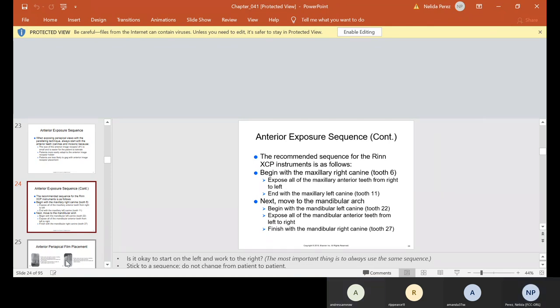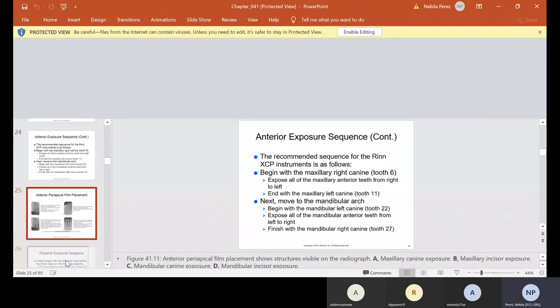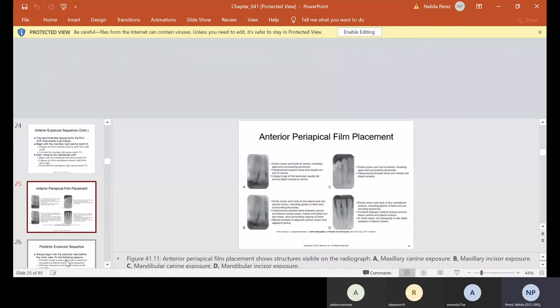It is always important for you to start on the same sequence, and if you always start on the same sequence, your time is going to get better. Here are your anterior periapical film placements — look in your Kindle or your red shelf at figure 41-11 because this is how you can identify when you're mounting how the teeth should look. In letter A, you have the entire crown and tooth of the canine, including apex and surrounding structures, the interproximal alveolar bone, and the mesial contact of the canine.